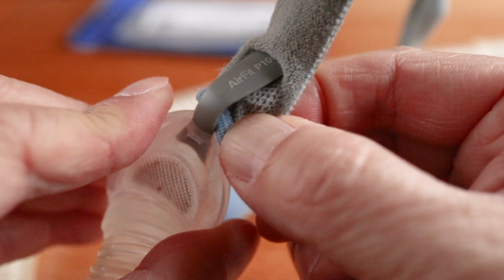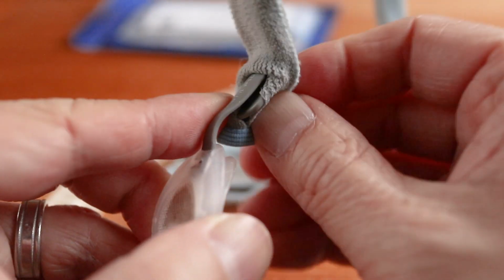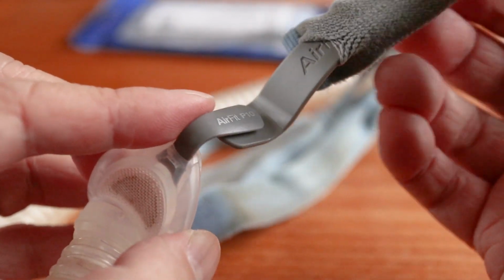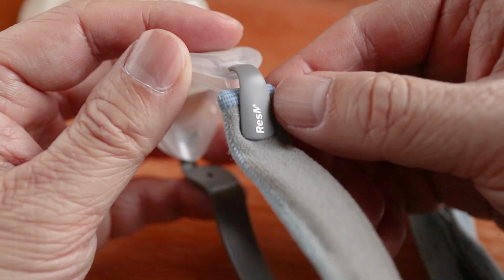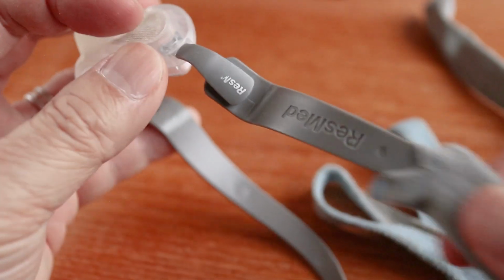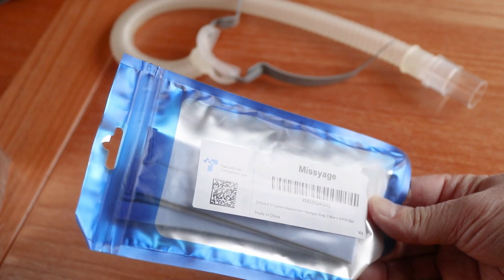So grab onto the bottom of the headband and pull it towards the nose piece. The elastic band will slip off like a button on a shirt. Then slide the entire thing off. Now just do the same on the other side. At this point I'll grab one of my new headbands.